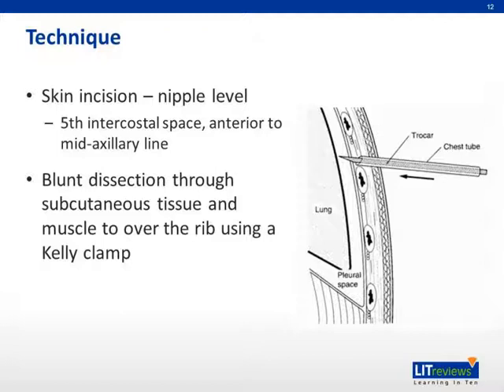In patients who may not fully cooperate or who are particularly anxious, gentle hand restraints may be useful to prevent inadvertent contamination of the sterile field. A sterile field is created typically in the mid or anterior axillary line in the fourth or fifth interspace. One dose of antibiotics, such as a first-generation cephalosporin, is given at the time of insertion.